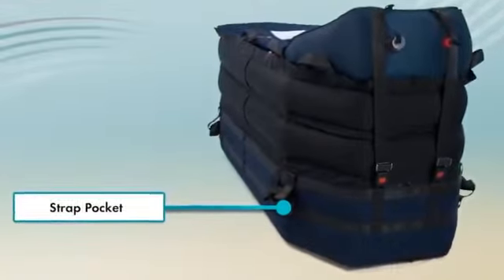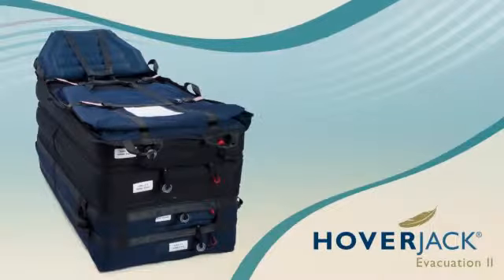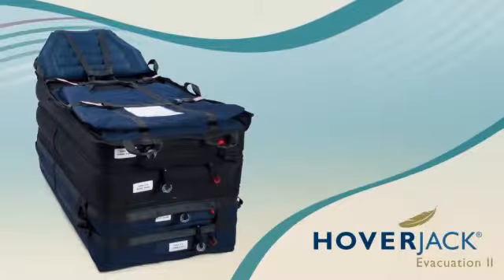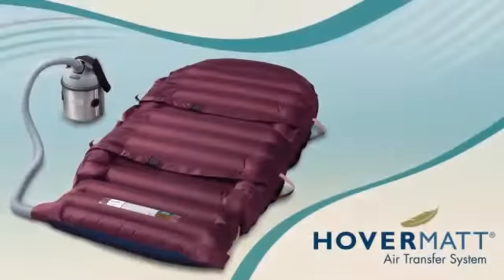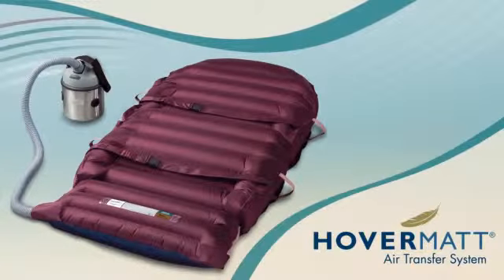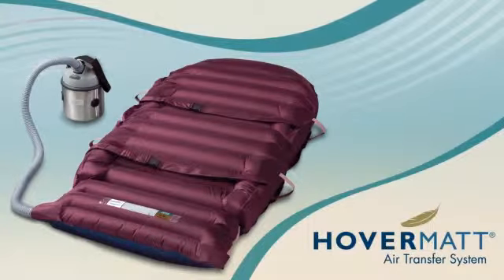To clean the Evacuation HoverJack 2, wipe it down after each use with a medical grade disinfectant. It is important to note that it cannot be machine laundered. If available, use the HoverMatt air transfer system to transfer the patient to and from the Evacuation HoverJack 2.